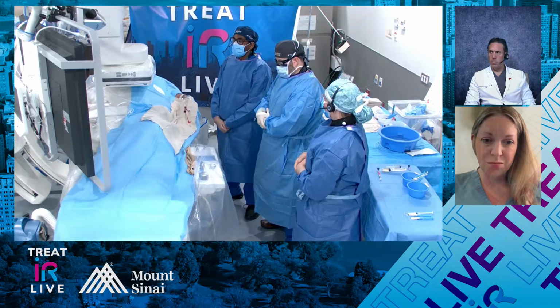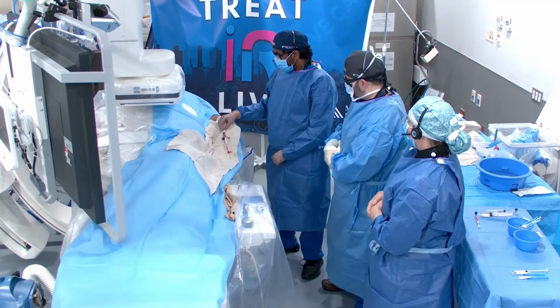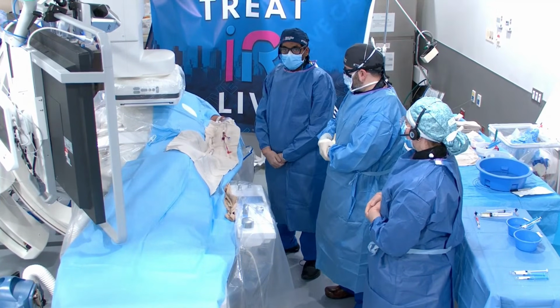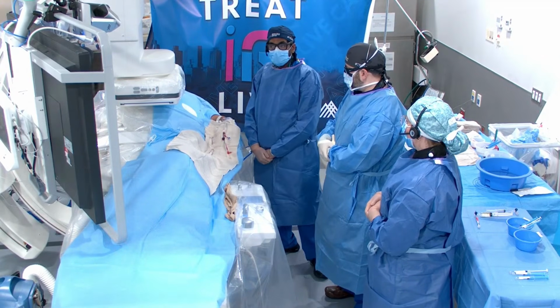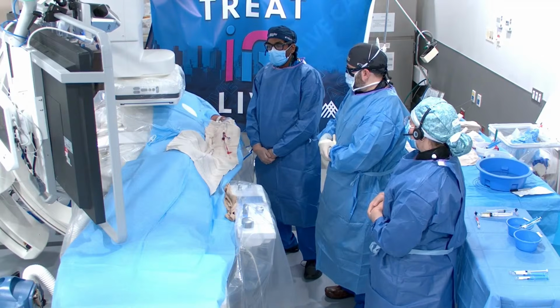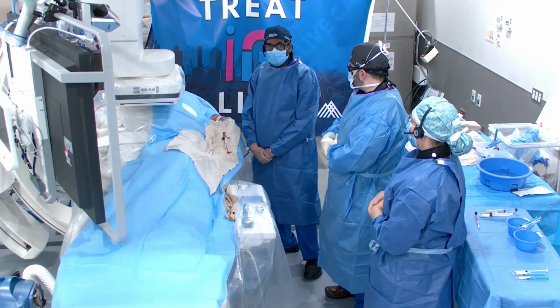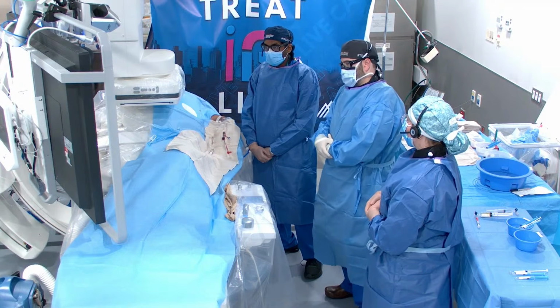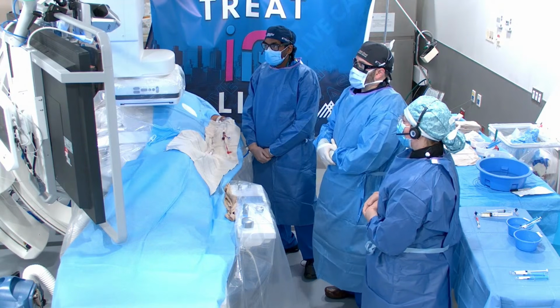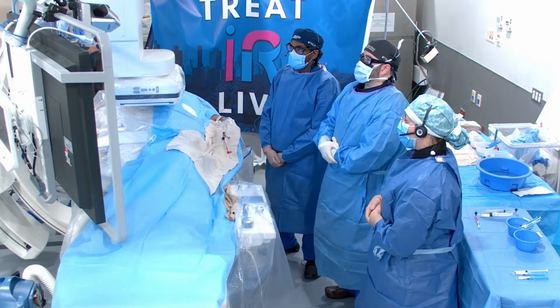So I have a 4 French 125 catheter here that we use to select the IMA. Admittedly, getting into the IMA from radial, I always have to spend a little bit more time than from the groin. So pick what you're comfortable with.